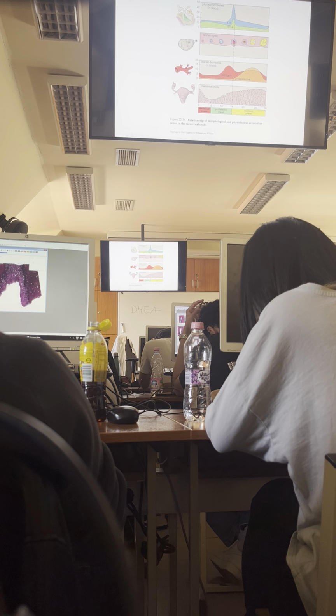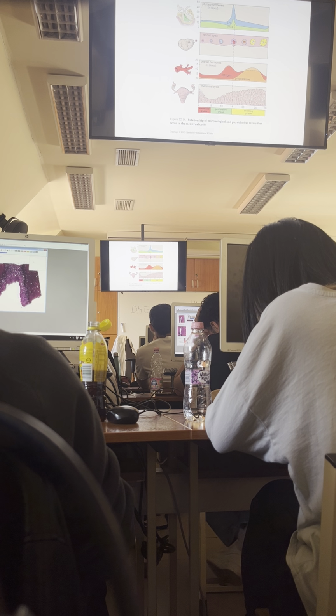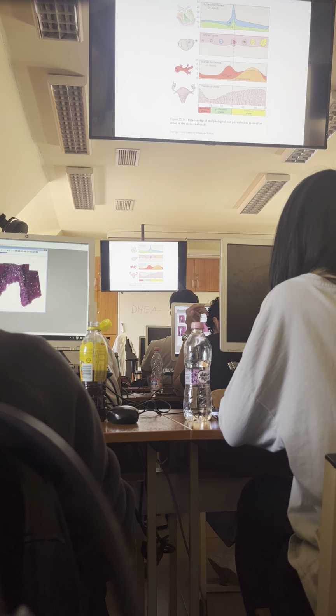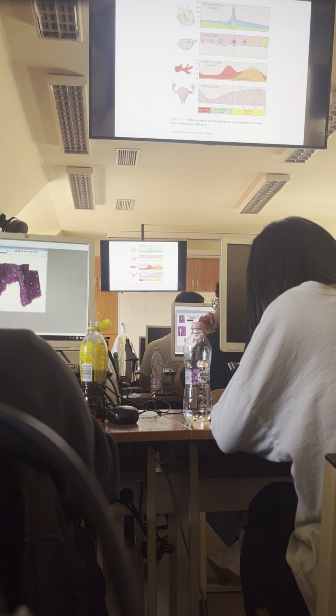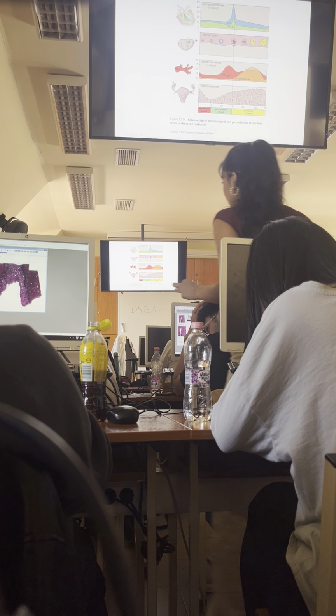In the second half, we call it secretory phase in relation to the uterus, and this terminology is coming from the fact that there are uterine glands embedded into the endometrium. These are represented by these irregular lumens, uterine glands, exocrine glands. These glands start to produce lots of secretory product, mostly in the secretory phase, mostly in the second half of the cycle.